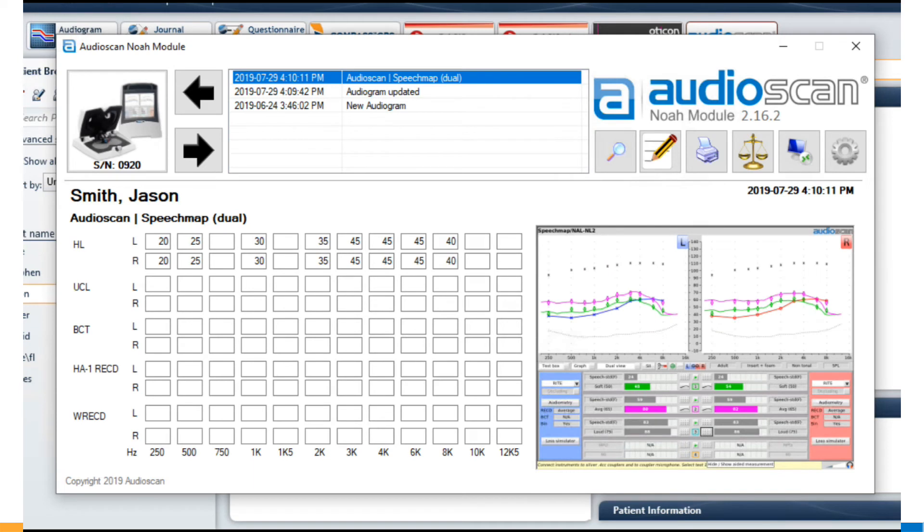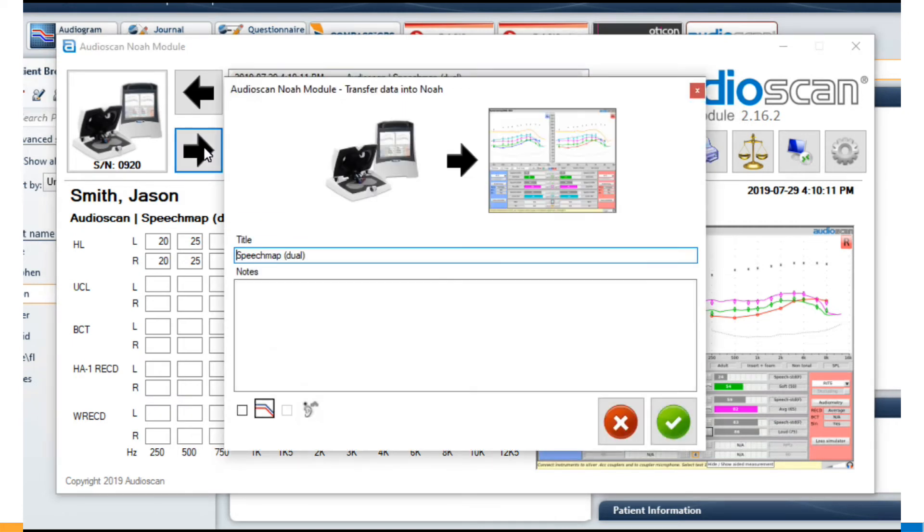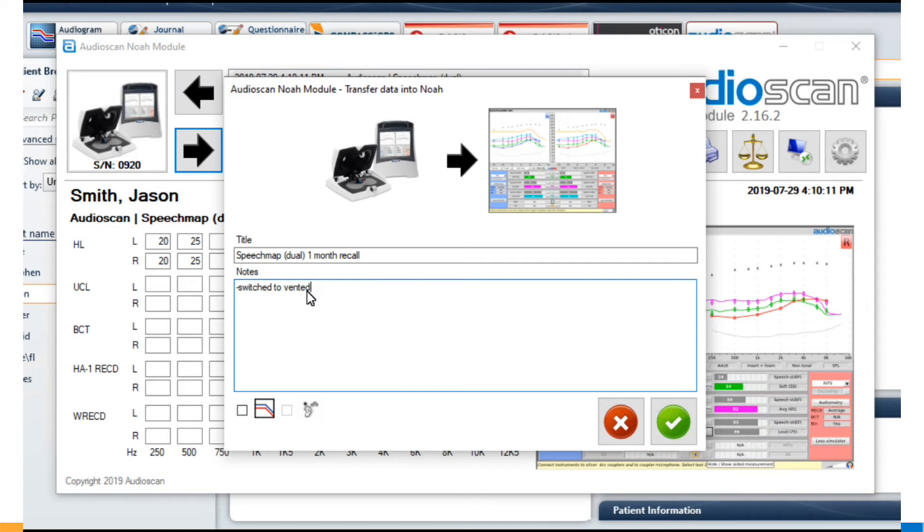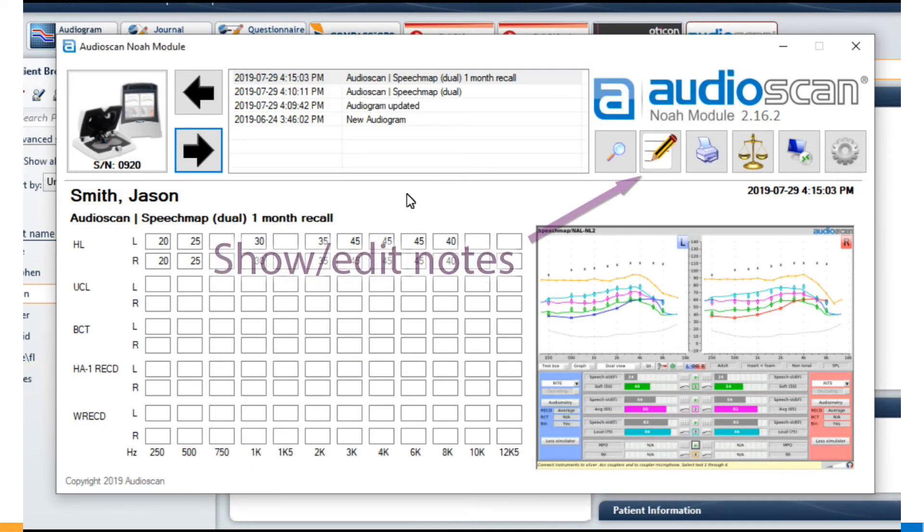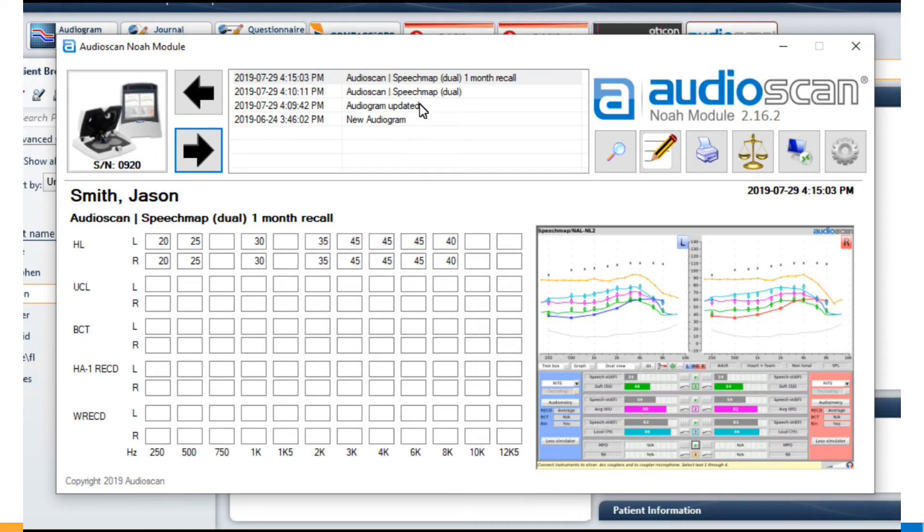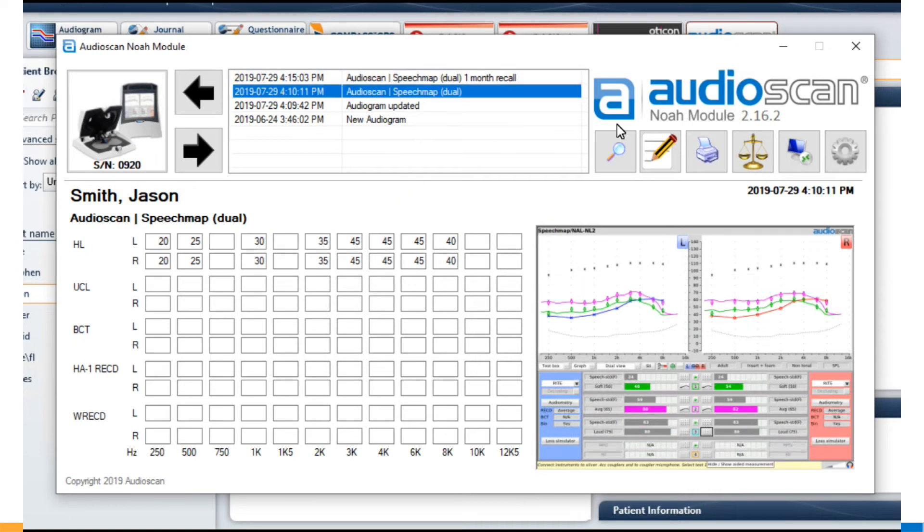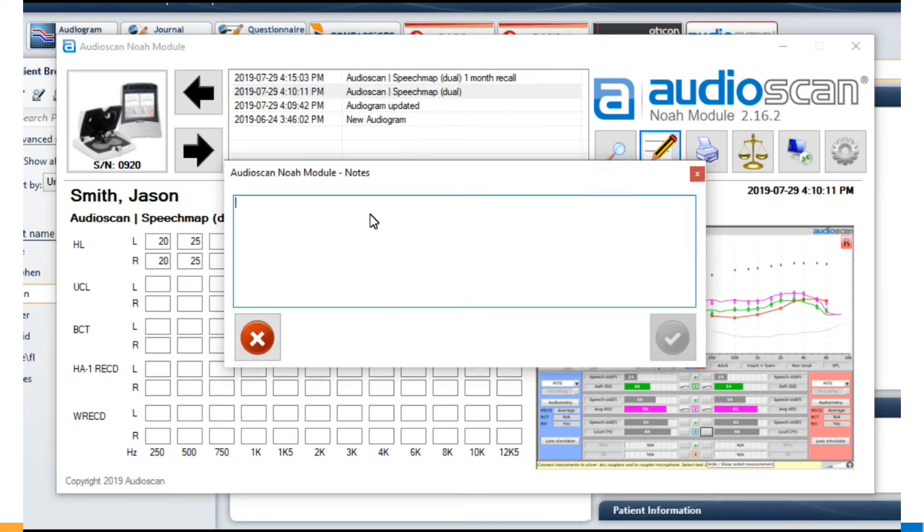Our Noah module has now implemented a much requested feature, the ability to add custom text notes with saved test results. When saving the result from the AudioScan, the usual preview window comes up, and you can customize the title of the action. Below this, there is now a free form text field, in which you can put any notes you want. These can be recalled later by clicking the notes icon. Selecting any earlier action and clicking notes also allows you to add or edit notes after the fact.